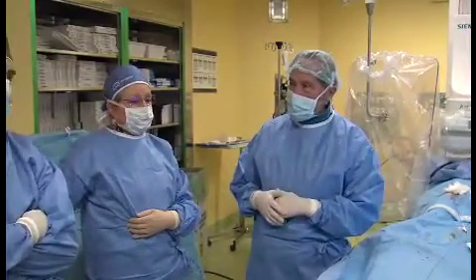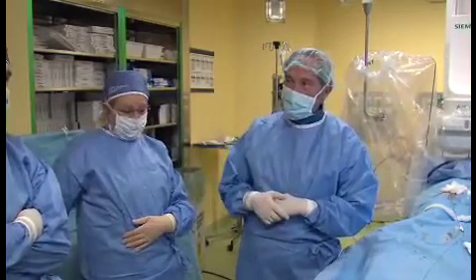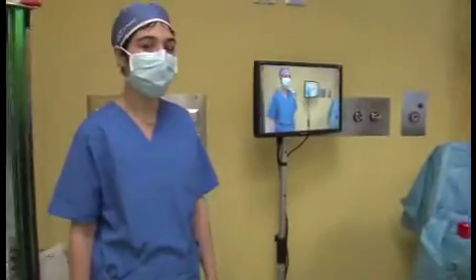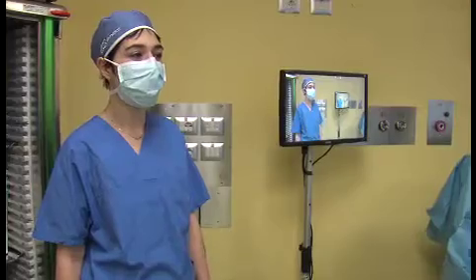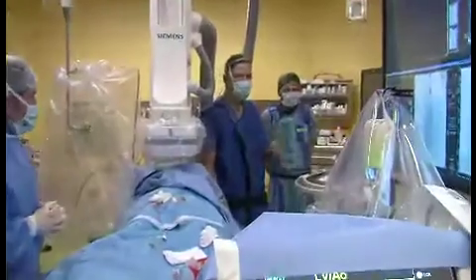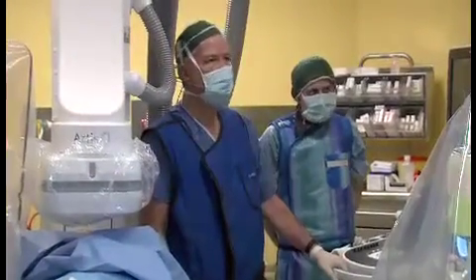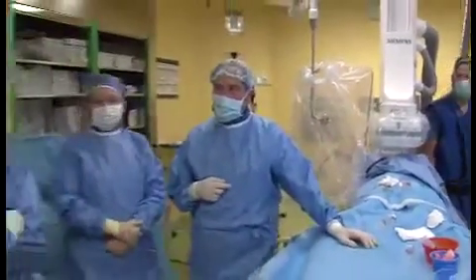We go straight to the first case we have here. Well, I'd like to show you Lucien and Luca on my right. Francesca Pluchinota will introduce the case, and this is going to be an ASD case. If you go with the camera, watching Aki Ludomischi and Angelo Micheletti, they will perform the transesophageal echo for us. So I pass the word to Francesca to introduce the case.